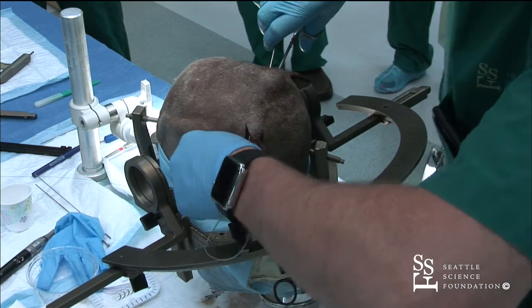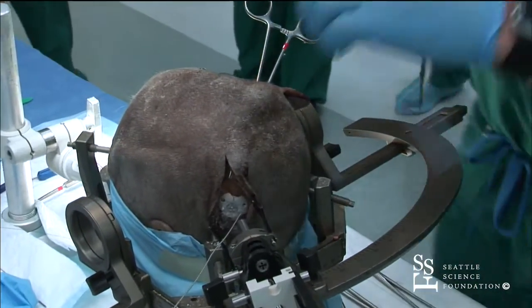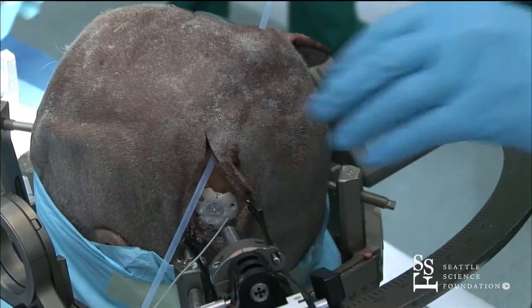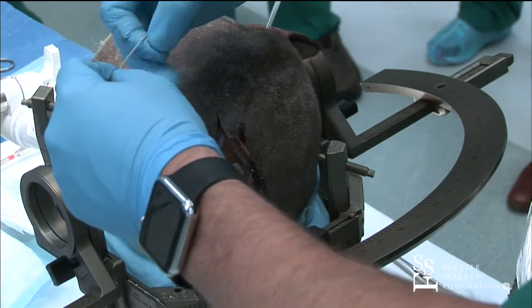And typically, maybe I should just show the safer way of doing it. You can put the straw in there and bring it through, and then pass the electrode through the straw.